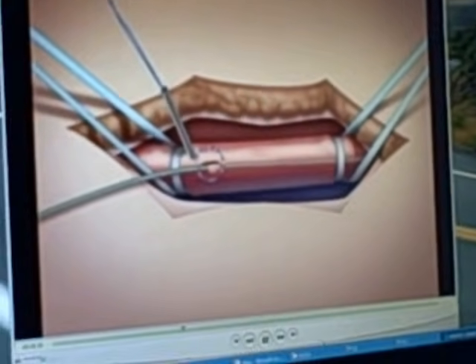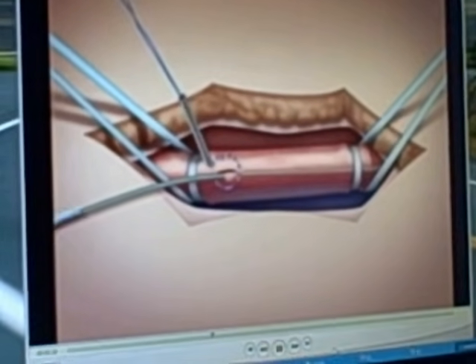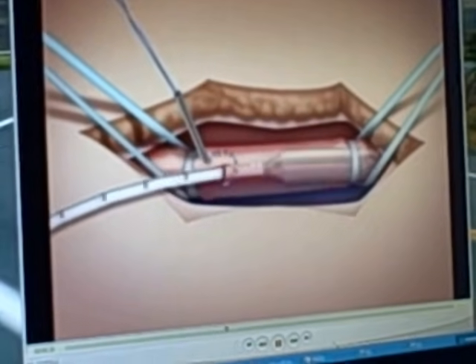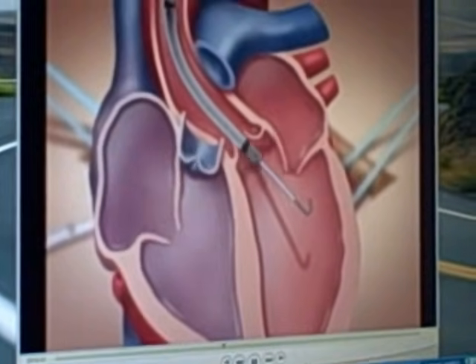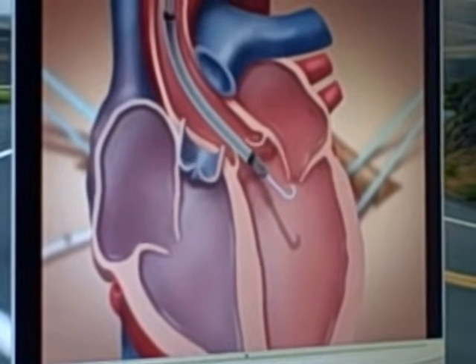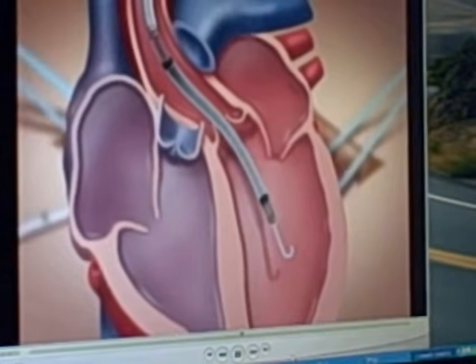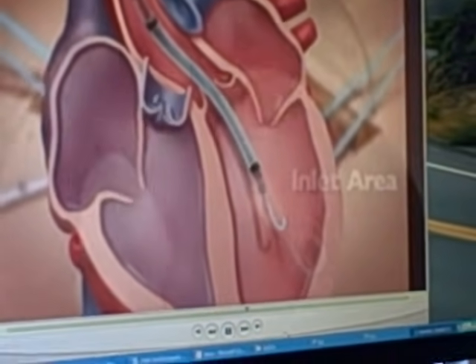A bigger incision is made into the femoral artery, and the device is then guided over the wire into the heart. You can see the device being pushed into the artery and advanced into the heart. Once advanced, the guidewire is withdrawn, and the device is pushed forward under fluoroscopy and/or transesophageal echo guidance until it is placed into the left ventricle.